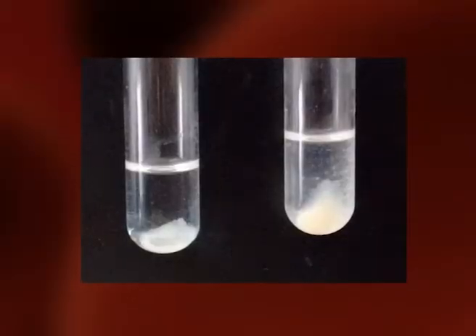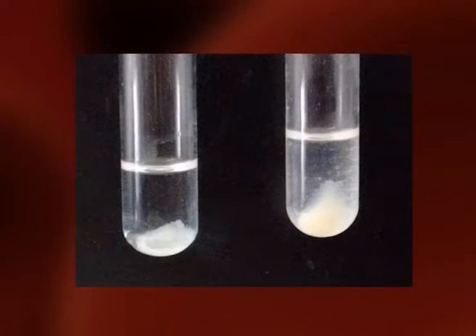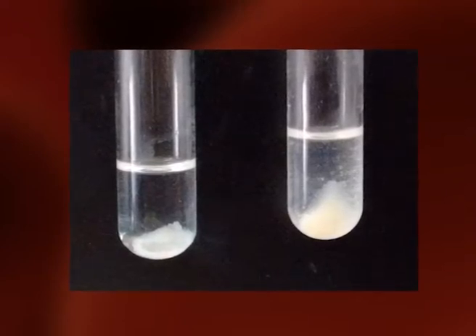These techniques are based on the precipitation reaction and are used primarily for species identification in forensic laboratories. Let us start with immunodiffusion.